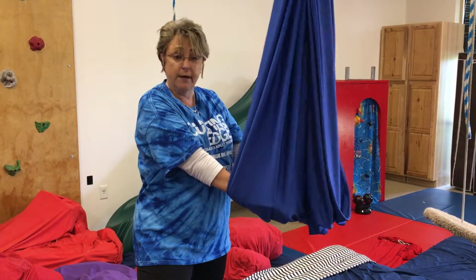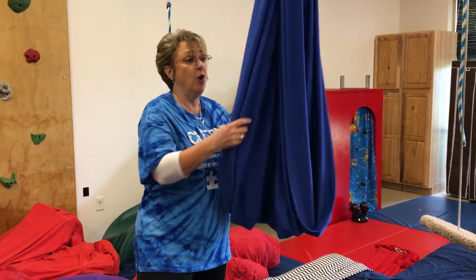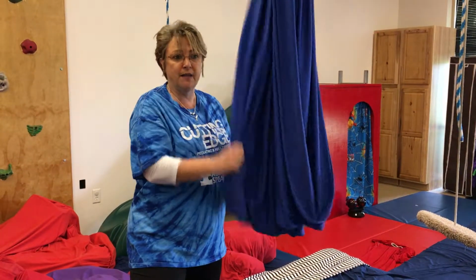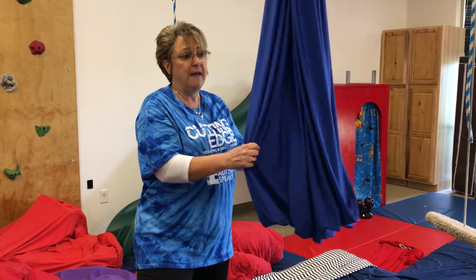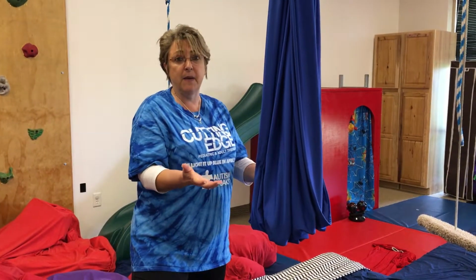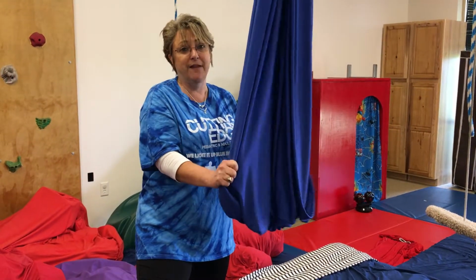We have some kids that are really afraid to be entirely in, so their head might be out, and it suspends in the air. We can take this swing and they can do bouncing motions, so we're giving them lots of proprioceptive and vestibular input. This is a great modulator, and the kids just love feeling suspended in space. It's a nice sensory experience. It's also really tough to get in and out of.